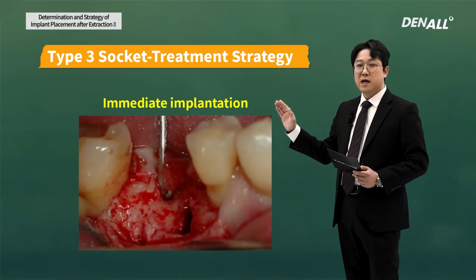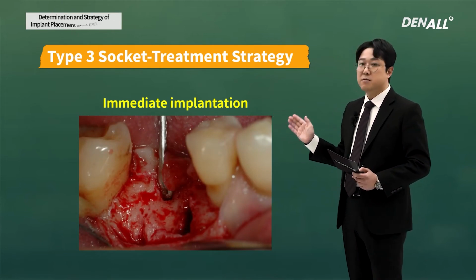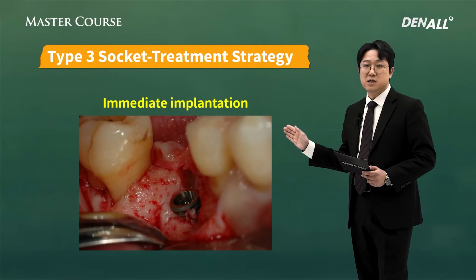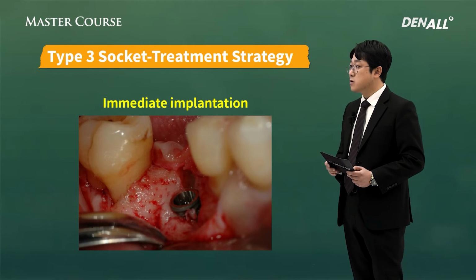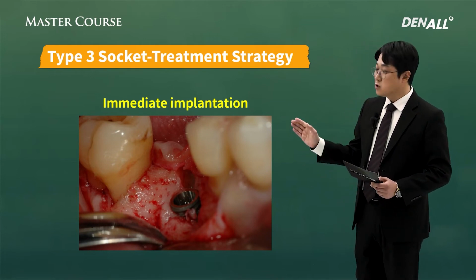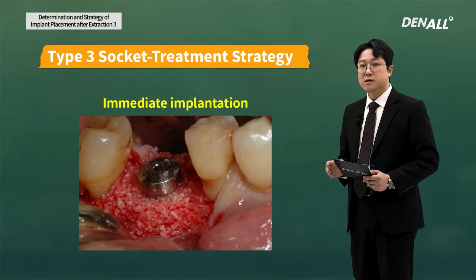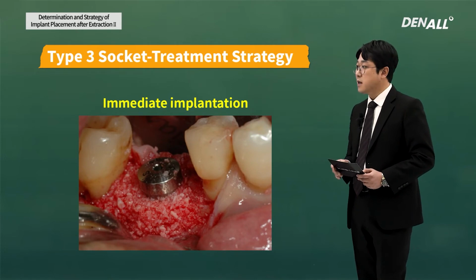The epithelialized granulation tissue was dissected to form a buccal flap, and after you open the flap, if you look, alveolar bone was not severely resorbed. And implant placement, there's no major difficulty. After implant was placed, you can see a little bit of thread exposure here. Xenograft was grafted, and as I mentioned, the transmucosal GBR was done.